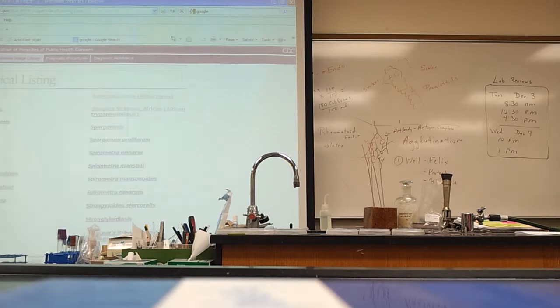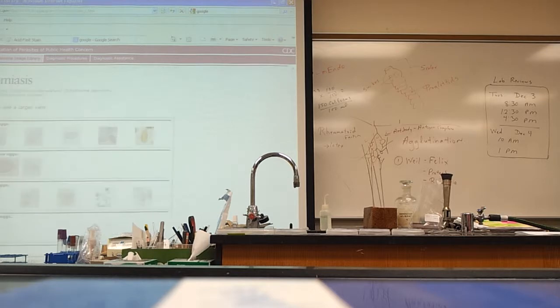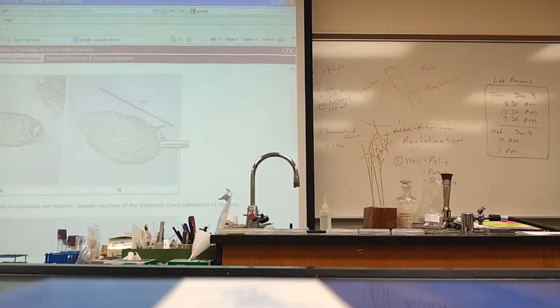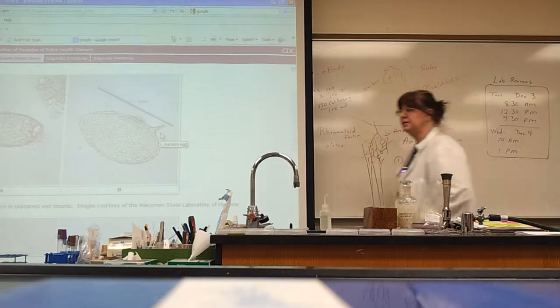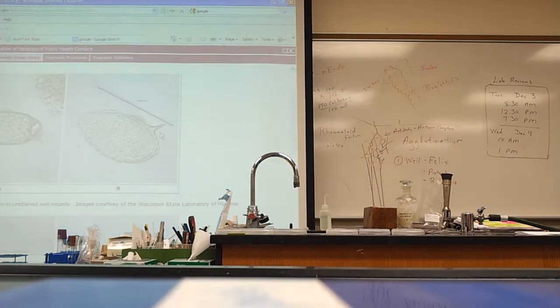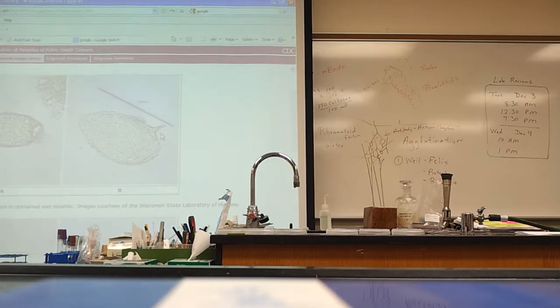Schistosoma has a very complex life cycle. Its egg has a spike. This is how Schistosoma runs. Somebody has the infection. The eggs are in the feces. Feces go out to the environment. Very bad for getting into water.